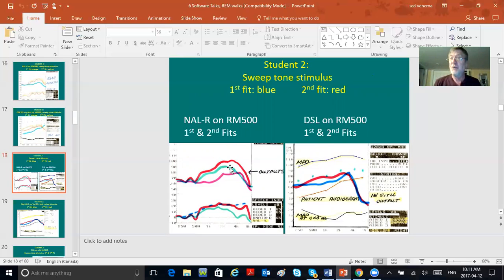Choose NAL on the real ear measurement software. Enter the client's audiogram on the real ear equipment. Okay. Choose NAL-R on the real ear equipment. Okay, go for it. What are you getting? And here's what you got. And here's how shy you are of target.